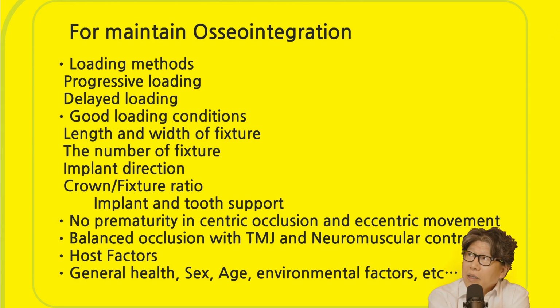Now, after that, there are a lot of things we have to think about to maintain osseointegration. There are a lot of loading methods, things like progressive loading. So provisional restorations, we do pretty much all of them. We do pretty much everything except single implant restorations and things like that. But we do progressive loading for singles as well. And then we do a lot of delayed loading.